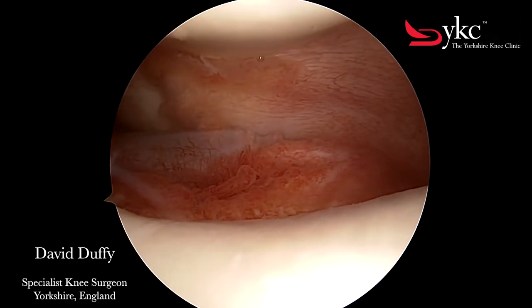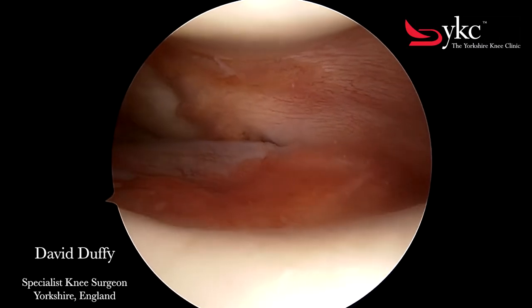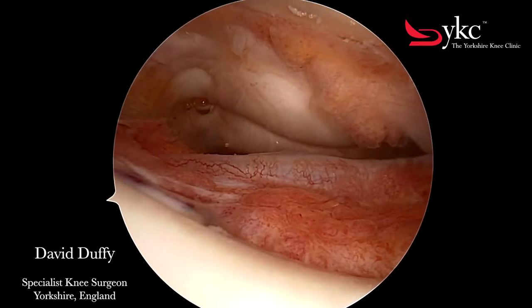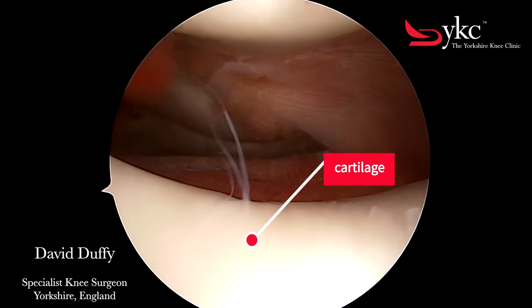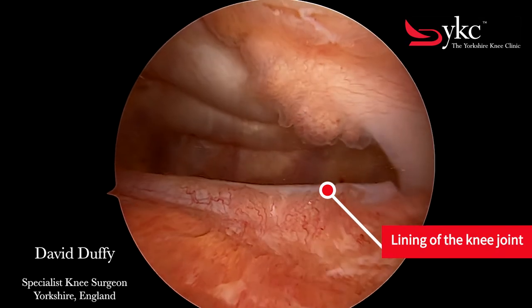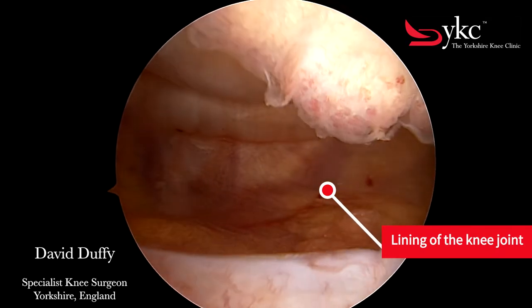The first thing to appreciate is that a normal joint has no blood in it. The white structure is the cartilage and the red is the lining of the joint, called the synovium.